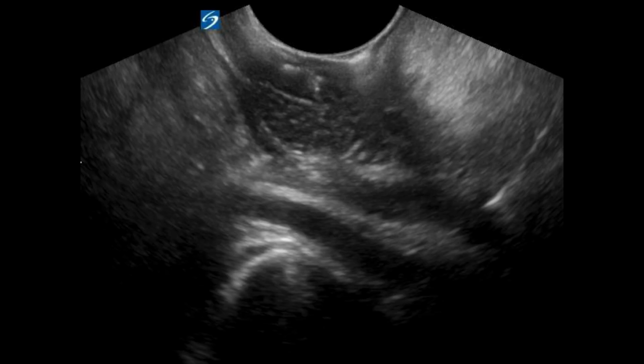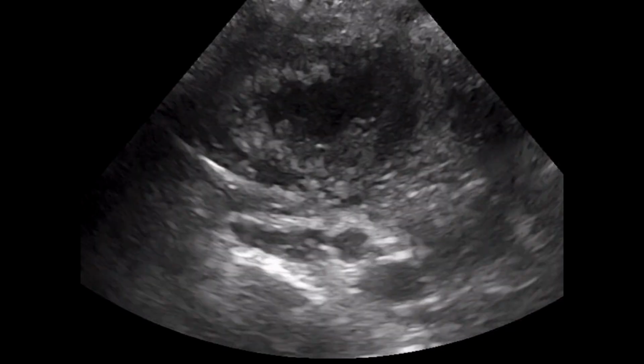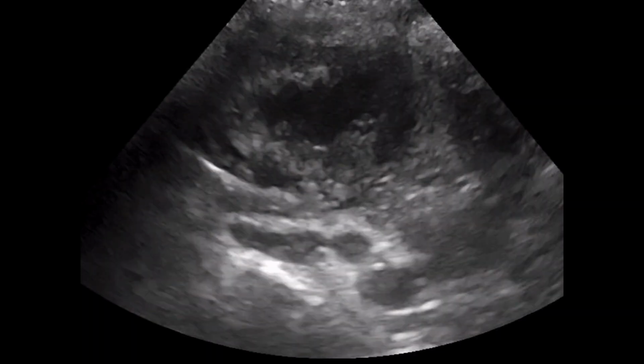But you're going to get an image like this. You're going to basically just put the transducer right against the tonsil. This long thing right here is actually the carotid artery, so you get a direct view of that. And then that right there is the tonsil. You're genuinely seeing it, okay? You can provide a little bit of pressure, and you can actually see that carotid pulsating with that pressure, which is a nice way of looking at this.